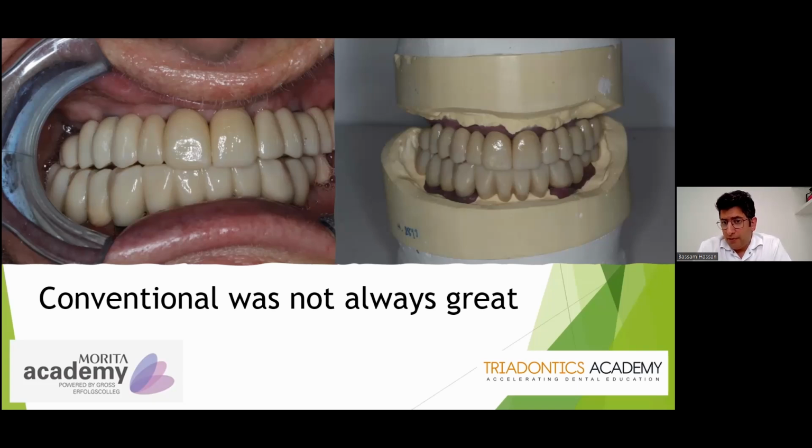It's just because there are multiple steps involved. You are pouring out a cast, you're mounting an articulator, and there are many chances for an error. And also your technicians are getting worse and worse by the day because everyone is going digital. So all those extremely experienced technicians in the past, unfortunately, they are retiring.